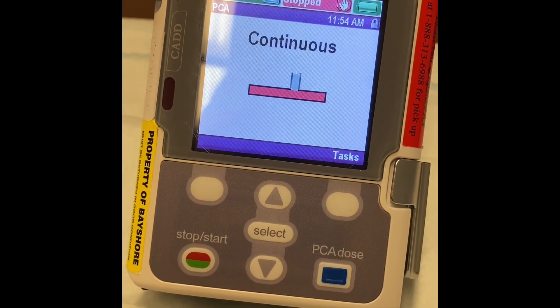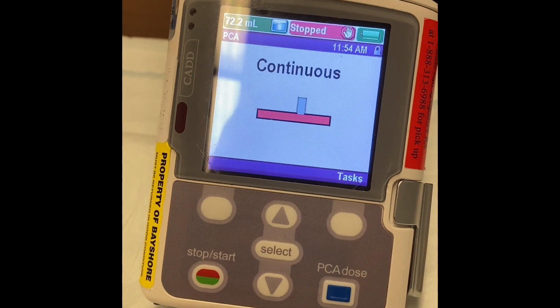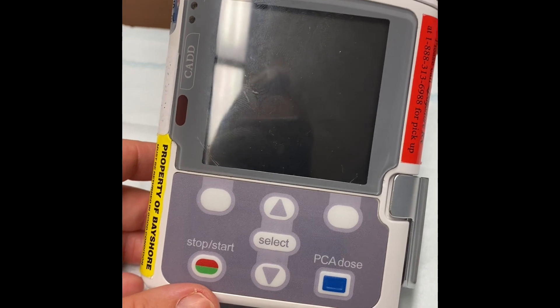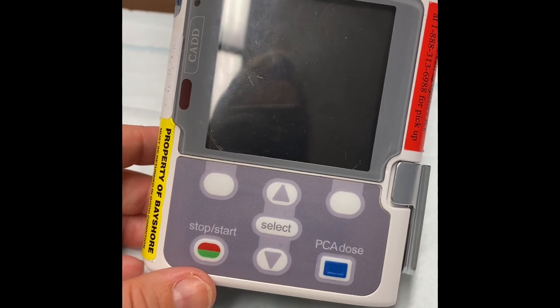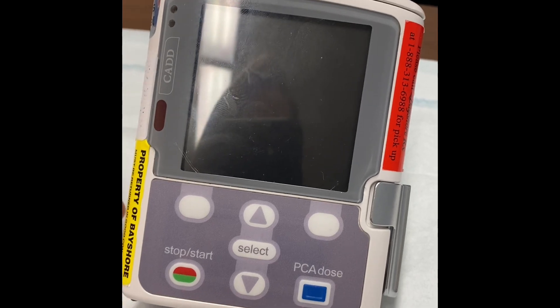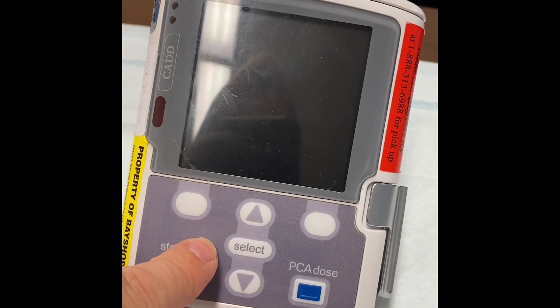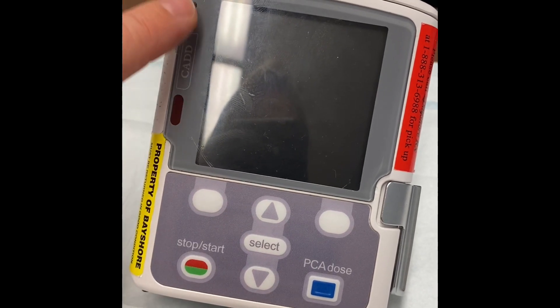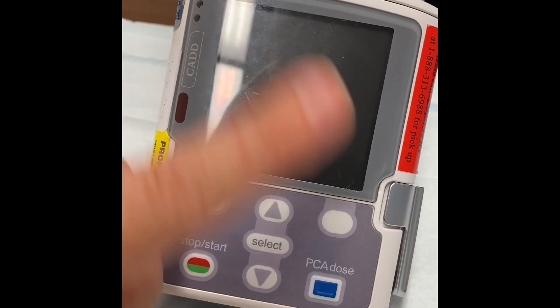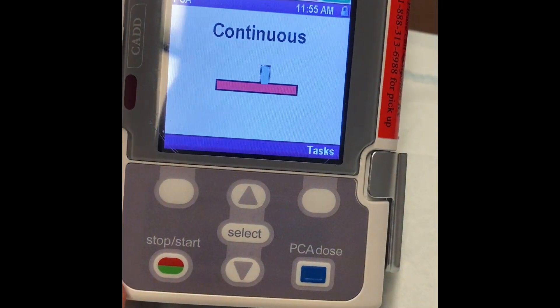Let's review the CAD pump when it's set into the PCA mode. The screen has gone blank because it does go blank after a certain period of time to save the battery. In order to get the screen to come back, you can press any of these soft key buttons. Note that the pump is still running — the amber light is blinking — so you know the pump is still running. Just press the soft key button to bring you back to the display screen.